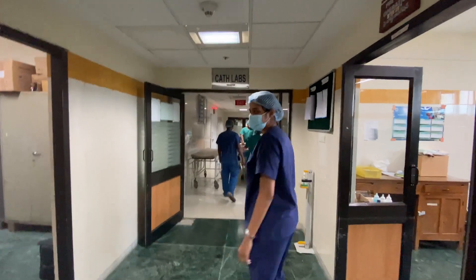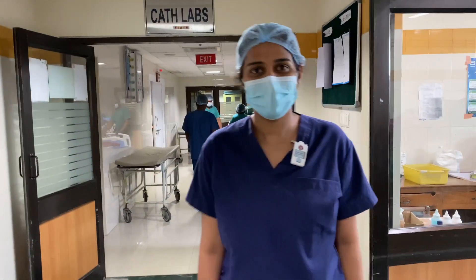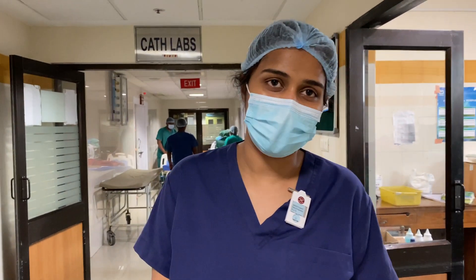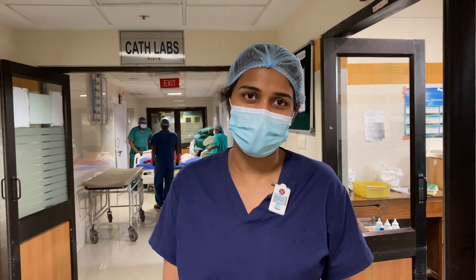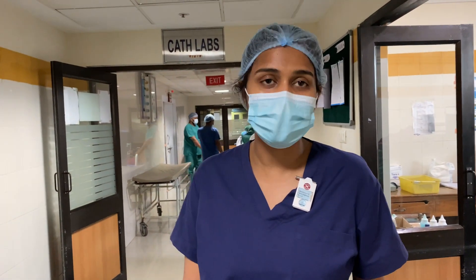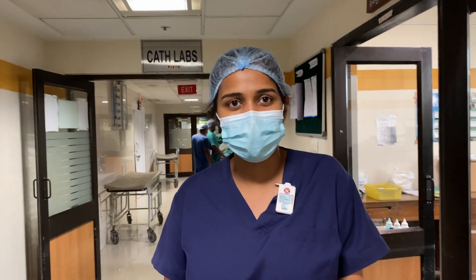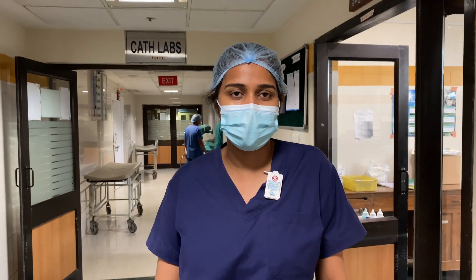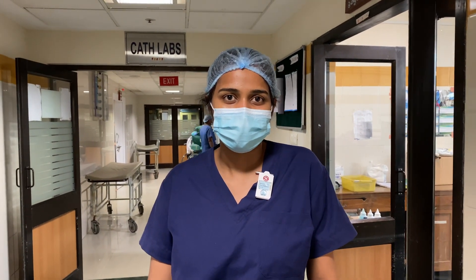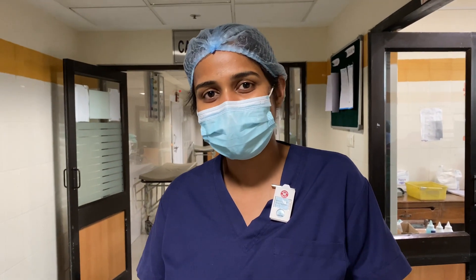Shilpa, what is this case? This is a case of acute necrotizing pancreatitis. The patient is having a bleeding collection, so we are going to do a visceral angio to look for any aneurysm or bleeding. And if we find bleeding, we will treat it by coiling.